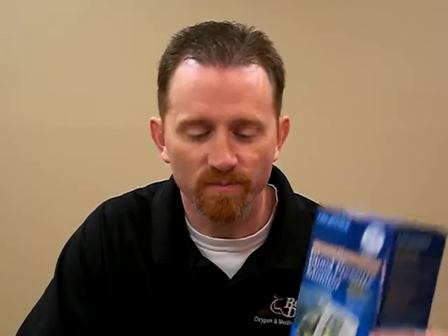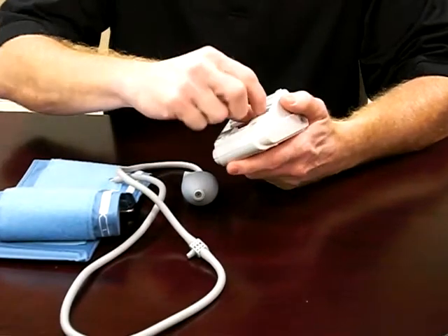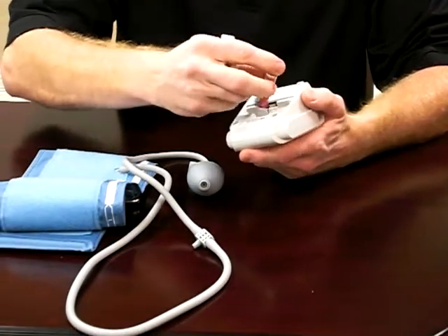This is Ross at Bex. Today we're going to go over digital blood pressure units. On your unit, when you unbox it, the first thing you need to do is put in your battery.